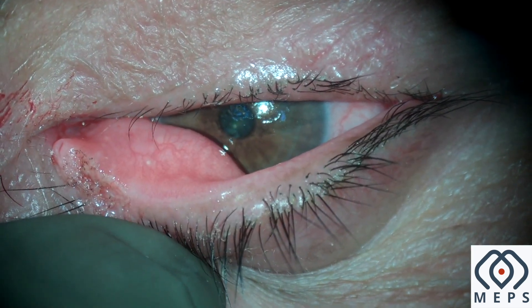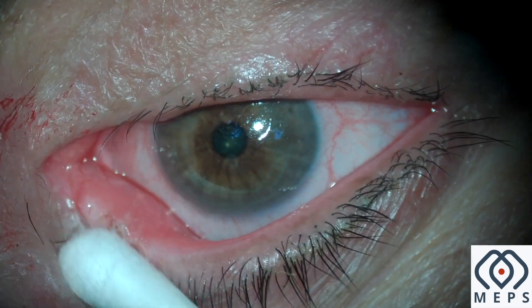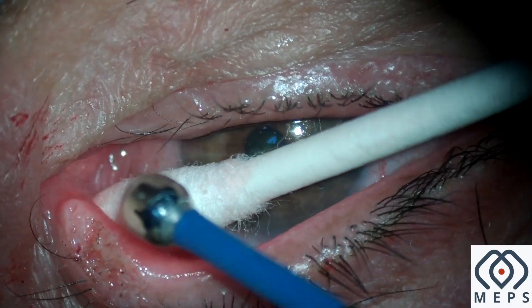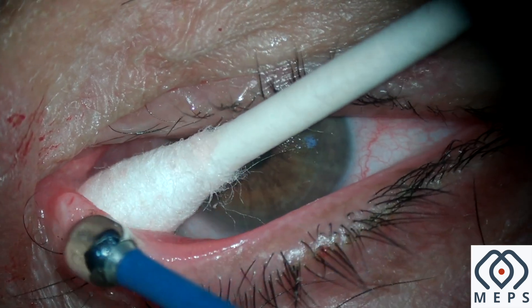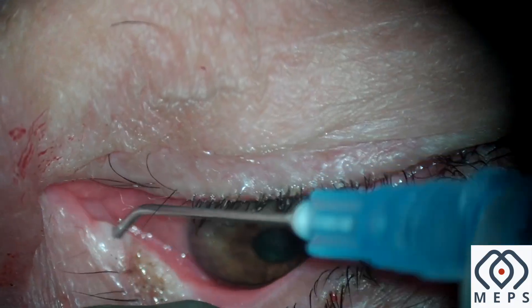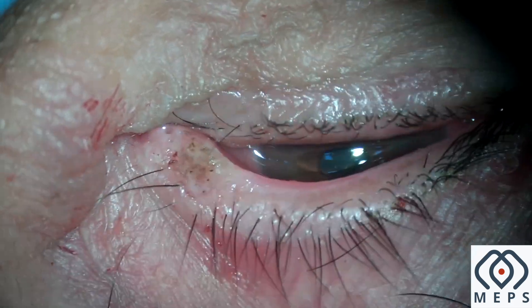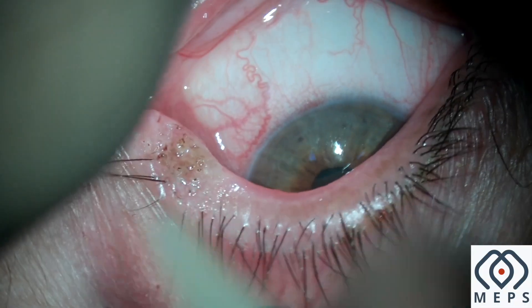Some of the microscopic remnant of the nevus cells can be coagulated with the help of a ball tip. I usually keep the lowest power setting for this. The lacrimal system can be checked and an ointment is instilled at the end of the procedure. Thank you.